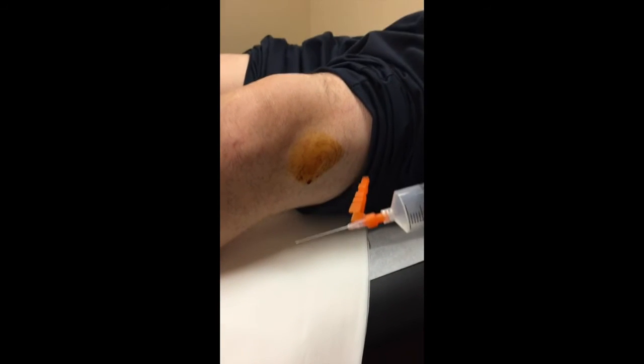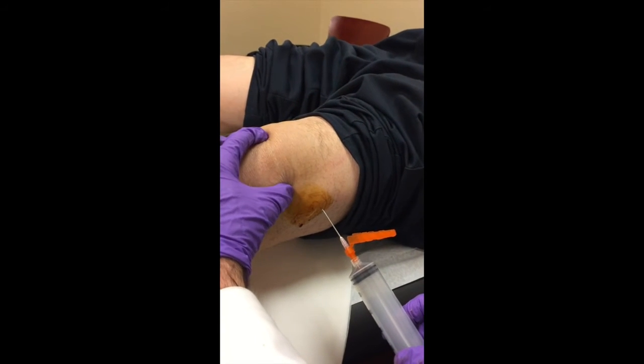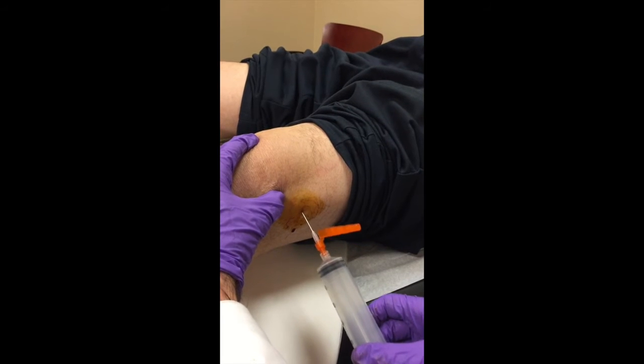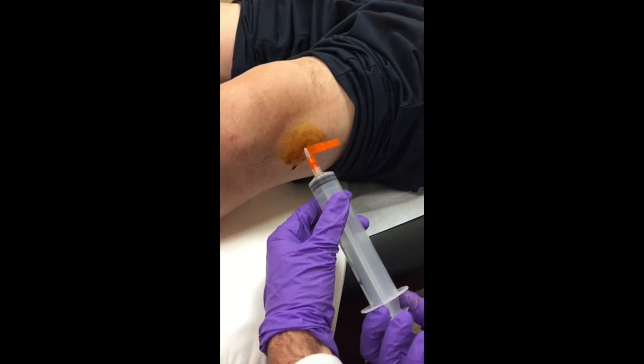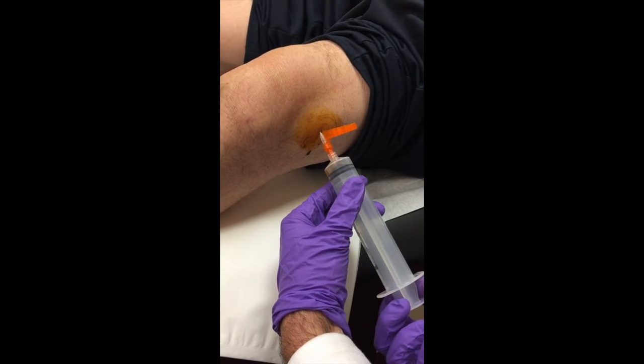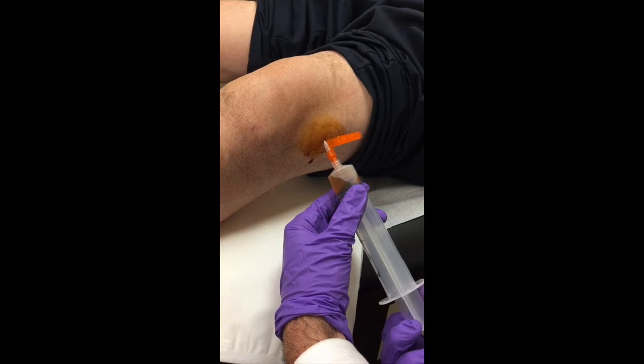We take our 18 gauge needle, make sure we can move air in and out and the needle doesn't fly off. Get our landmarks — feel a pinch on three: one, two, three. Once you get in there you'll feel a pinch and then a pop, then slowly withdraw the fluid. It's often going to be slightly blood-tinged from putting the local medication into the capsule.